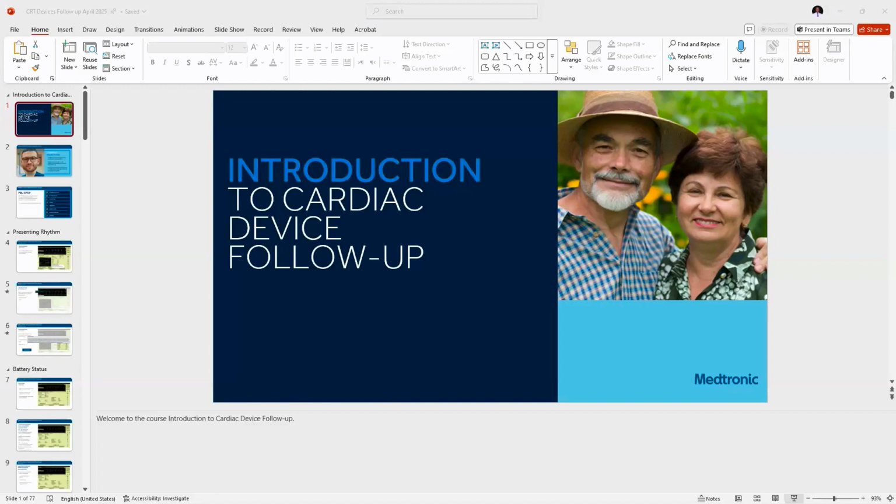So for quadripolar devices, this one gives you a variety of options. You have 16 pacing vectors. So if in case you have diaphragmatic stimulation in 2 of your pacing vectors, you have a whole range of other vectors that you can use to program and pace.